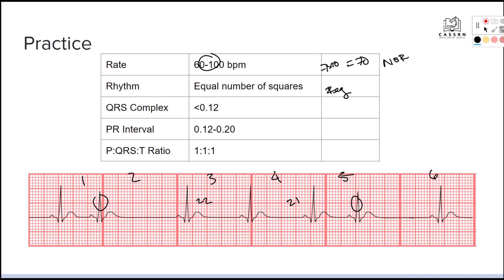Then we look at our PACs. Counting the interval around the first PAC gives us 13, and counting the interval around the second PAC also gives us 13. So we are going to call the rhythm regular, but irregular where the PACs occur — so regular and irregular.